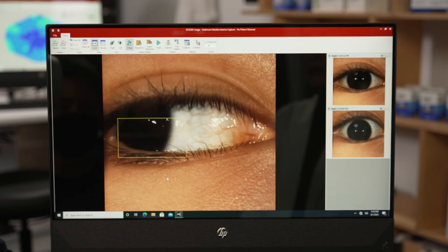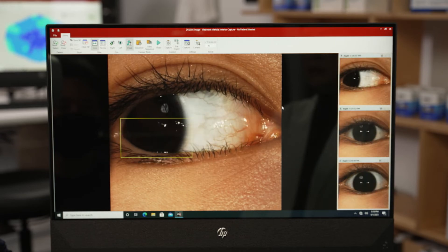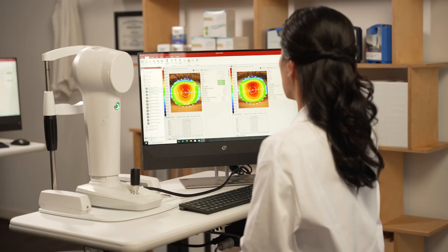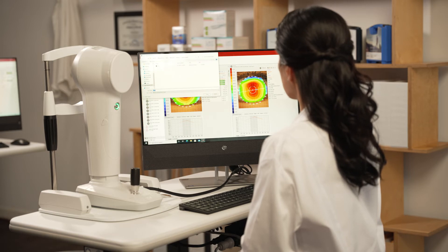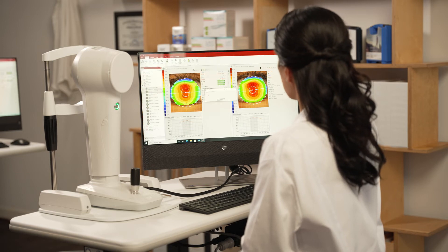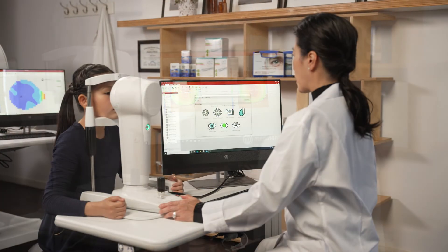With any of the captures that you can take with your Medmont Meridia, you can quickly and efficiently export a file so that it can be emailed or sent to your specialty lens consultant when you need assistance with a particular case.